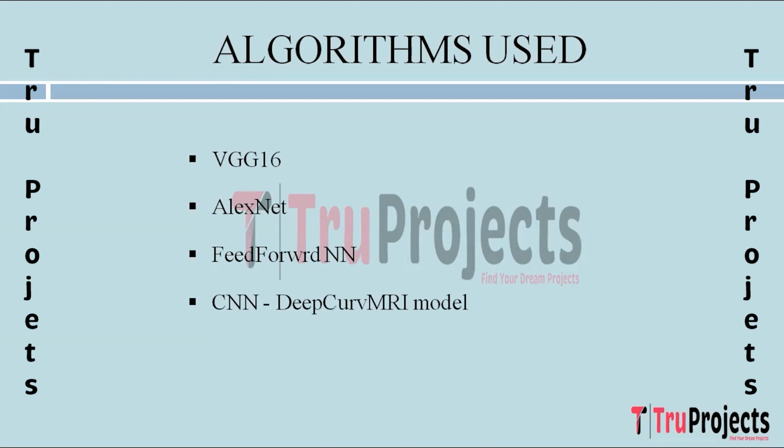The next algorithm built is a CNN, DeepCurveMRI model. So, our custom CNN architecture, DeepCurveMRI, integrates curvelet transform for feature extraction from MRI images. This model is specifically tailored for Alzheimer's diagnosis, leveraging the strengths of CNNs in image analysis while incorporating advanced feature extraction methods for improved accuracy.